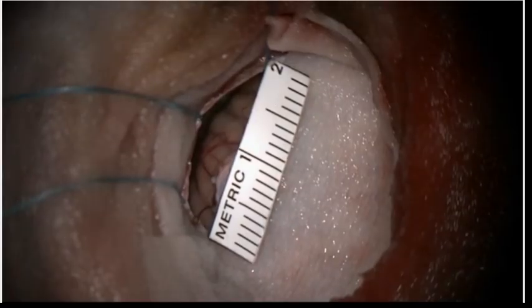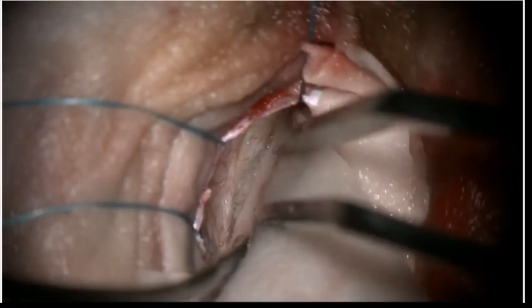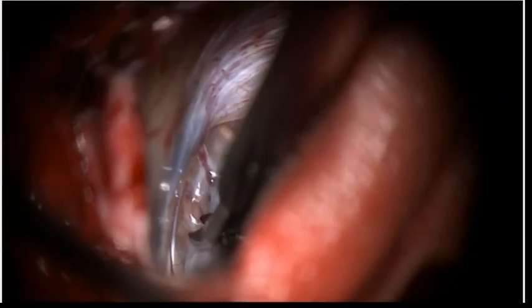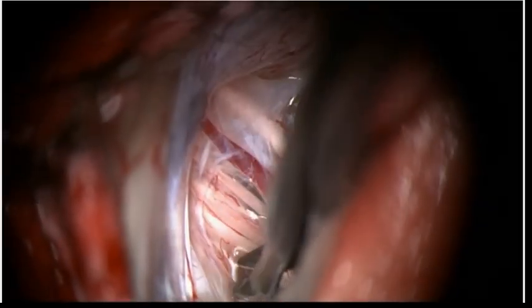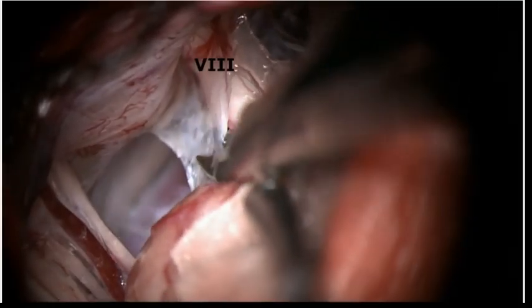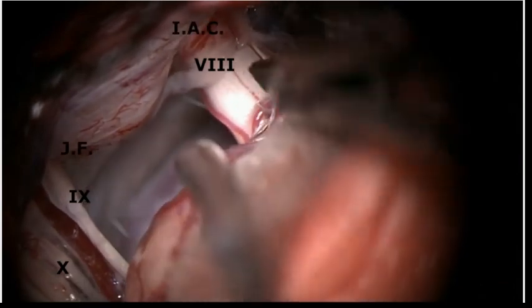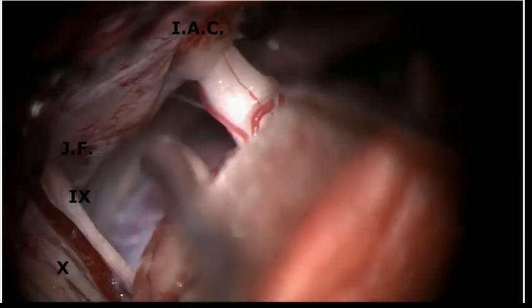After straight incision of the dura, following the medial margin of the sigmoid sinus, dissection of the arachnoid is started under the operative microscope. With good positioning, the cerebellum folds back after CSF drainage, exposing a working corridor between the cerebellum and the skull base without relevant retraction. The arachnoid around the cranial nerves and vessels is carefully dissected. The vestibulocochlear nerve is identified above the inferior cranial nerve group and the jugular foramen leading to the internal auditory canal. The facial nerve is hidden behind the vestibulocochlear nerve.